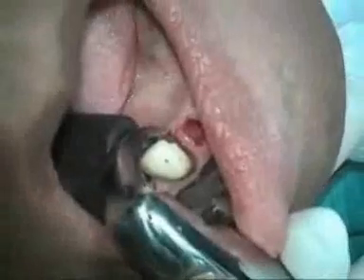This canine is the one that has been endodontically treated. It has a crown and a post in it. With that small movement the tooth was disengaged from the socket and then it is elevated occlusally in order to be removed.